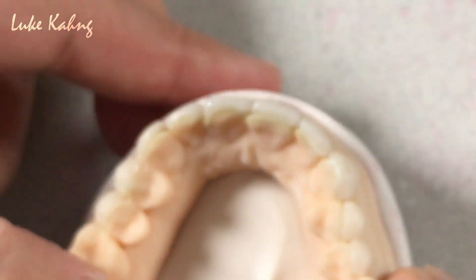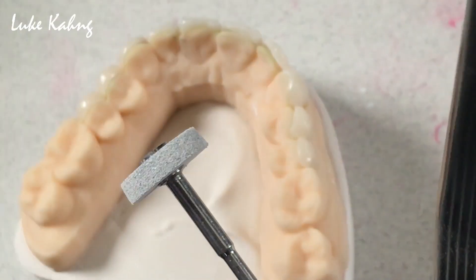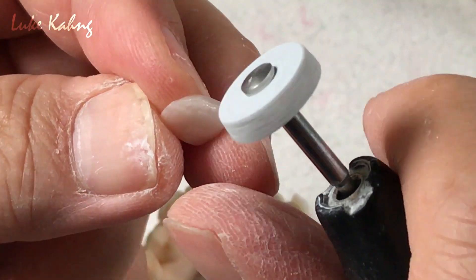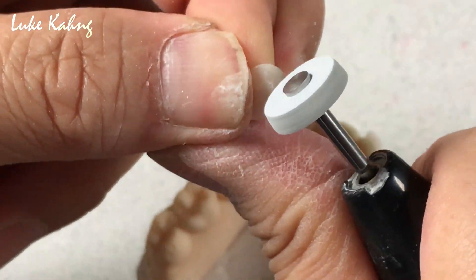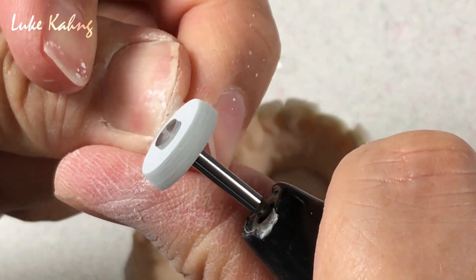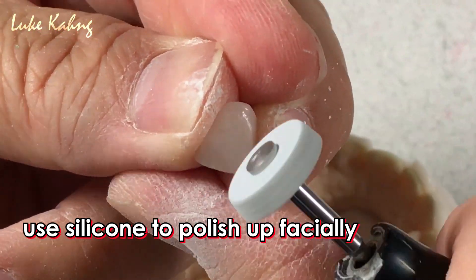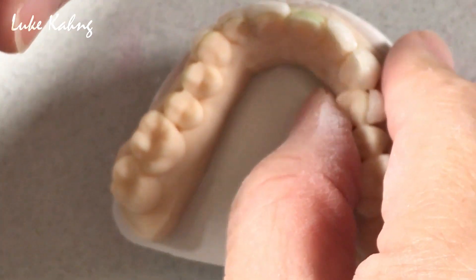The other final tip — see here. After I use this, it's still not right. And then I'm using silicone — you can buy any store with silicone. Then I can decrease more. I will maximize it more at slow speed, like this. So I can get the maximize technique. You can even polish them up facially. I can polish if I want to — I don't need glazing actually.